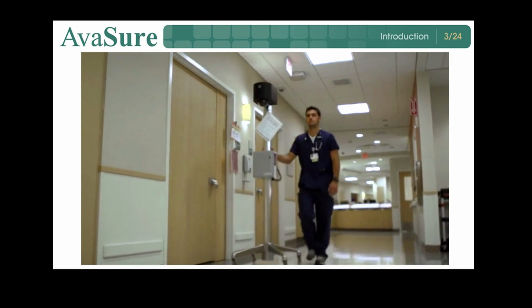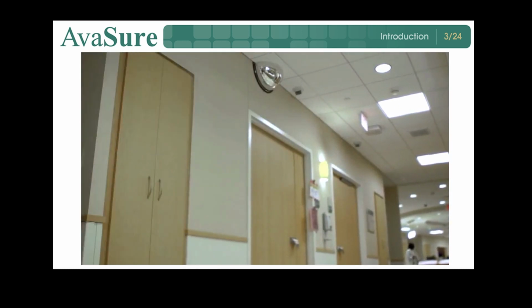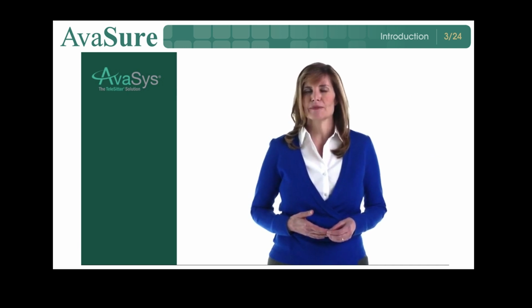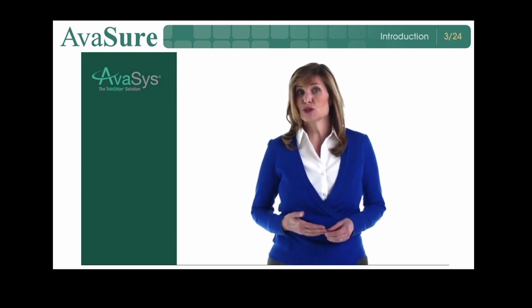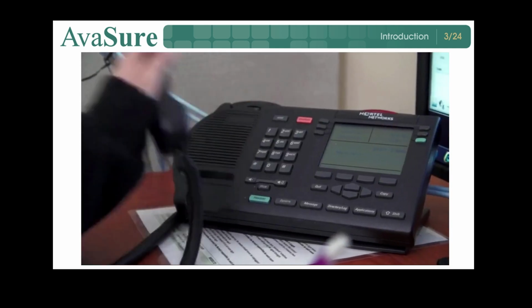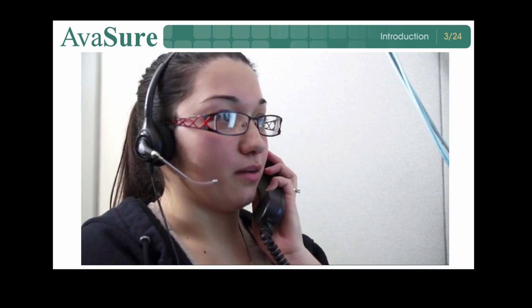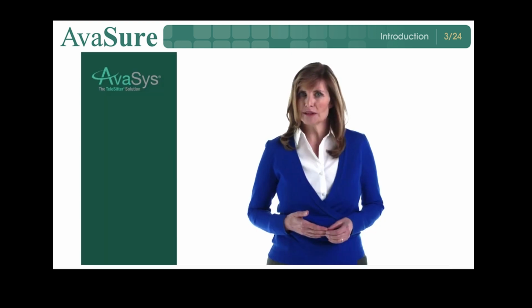Appropriate staff will then clean the monitoring unit and return it to the storage location. You will find that this system requires very little troubleshooting. However, if downtime is required, whether planned or unplanned, the observer's first duty is to notify the clinical staff that monitoring on their patient will be interrupted. AvaSure has a support line staffed 24 hours a day, 365 days a year for any and all user questions.